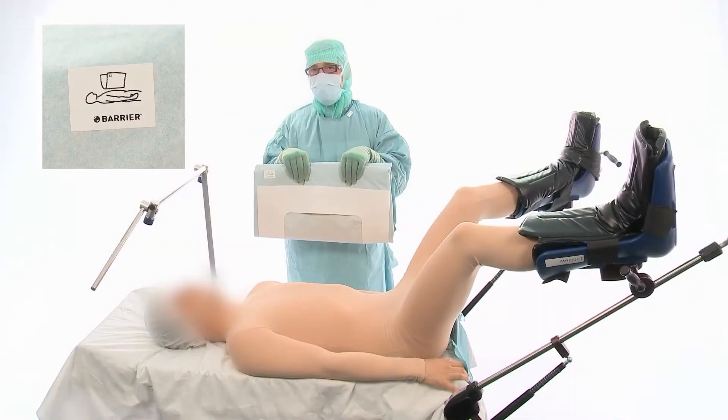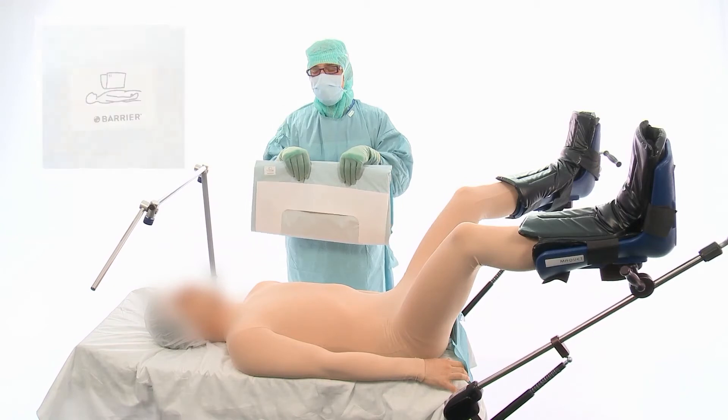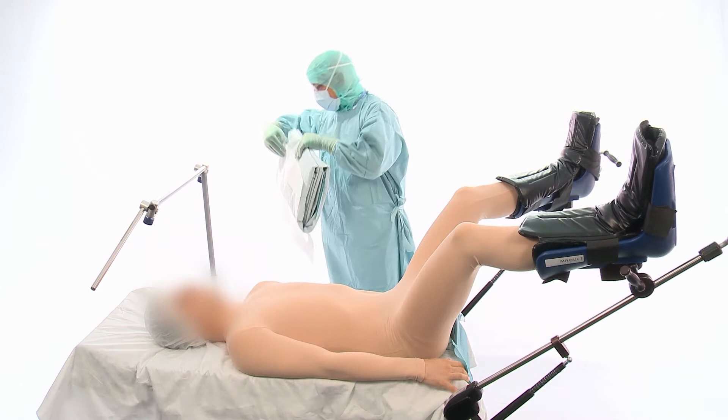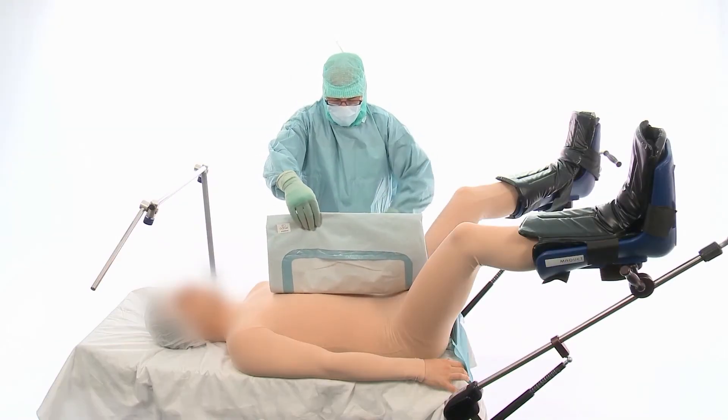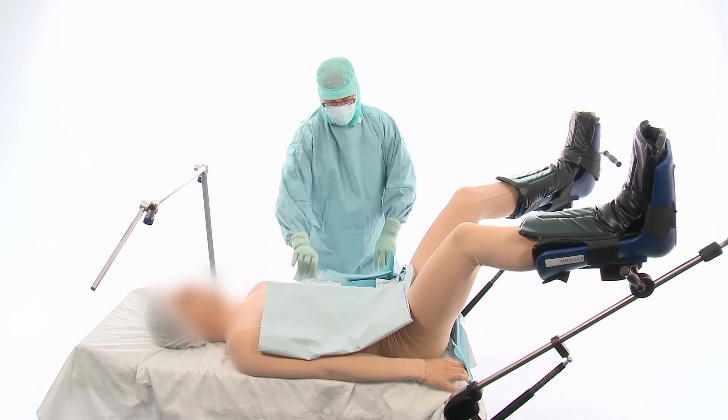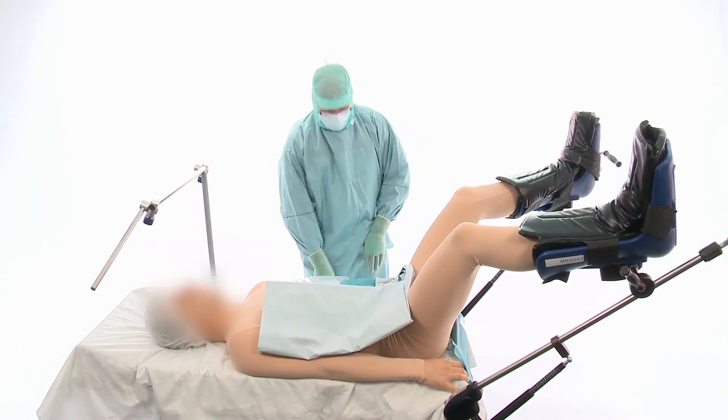Note the direction of the pictogram on the laparoscopy drape. Remove the release paper. Place the drape centred on the patient. Unfold towards yourself and then away from you.